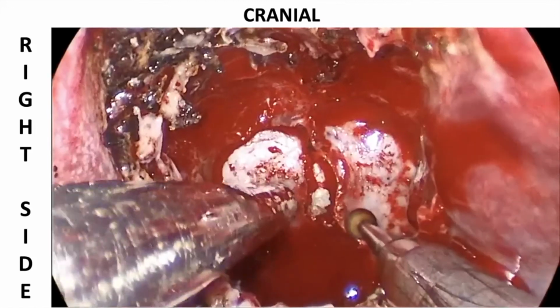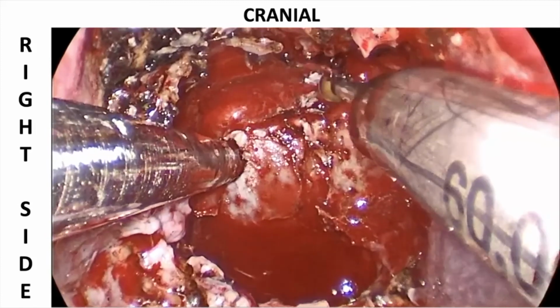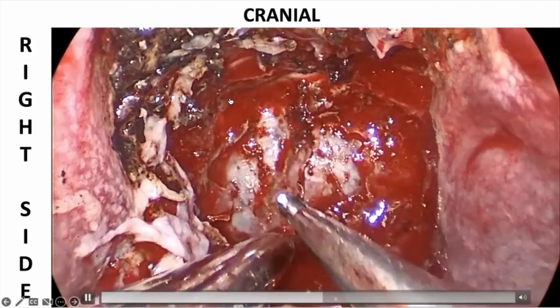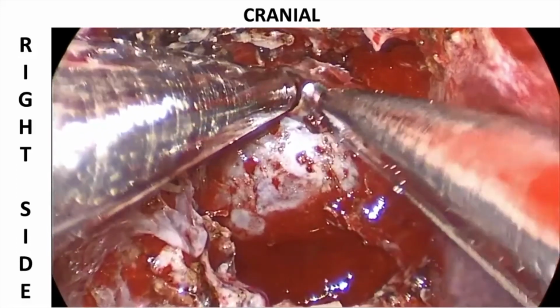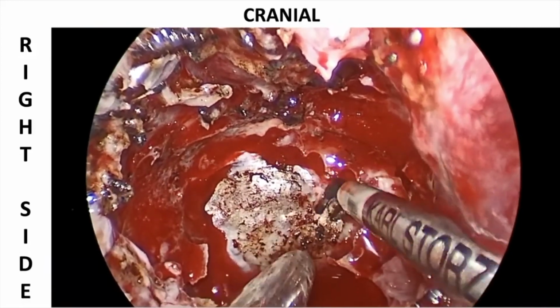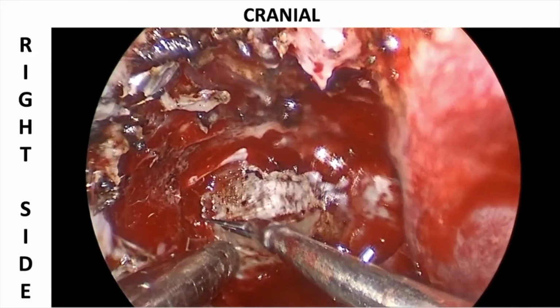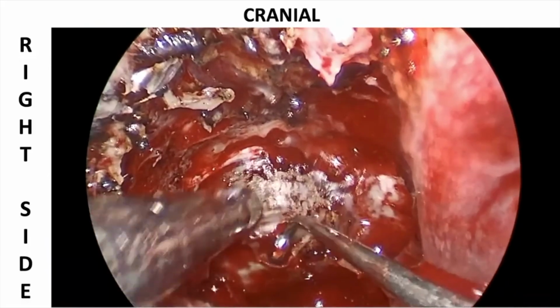bone being removed, and now the drilling of the sellar floor, including the planum superiorly, because this patient had a large suprasellar extension. So I have discussed that if there's a large suprasellar extension, you have to extend your bony opening on the tuberculum sellae also, and part of the planum may be required depending upon the size of this. This is the dura being opened.